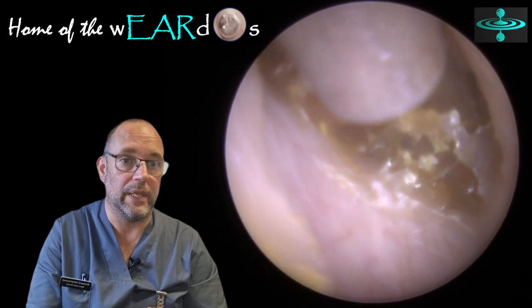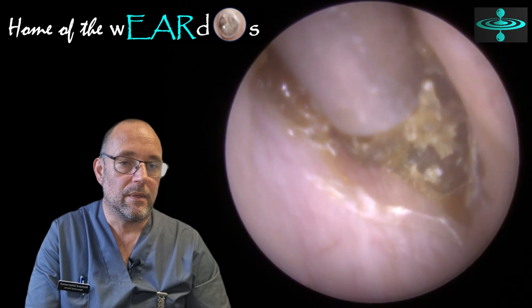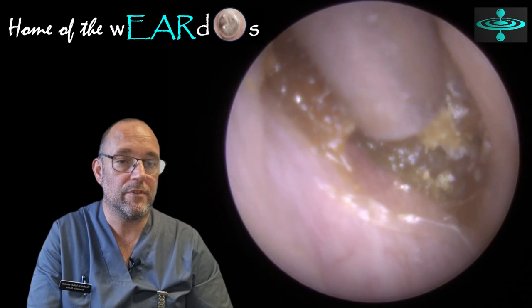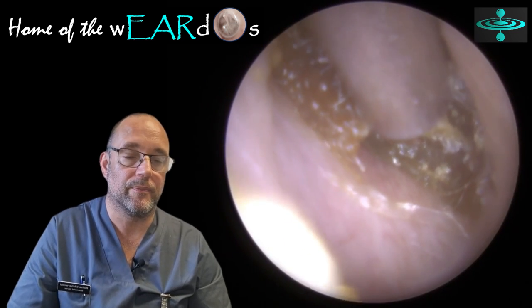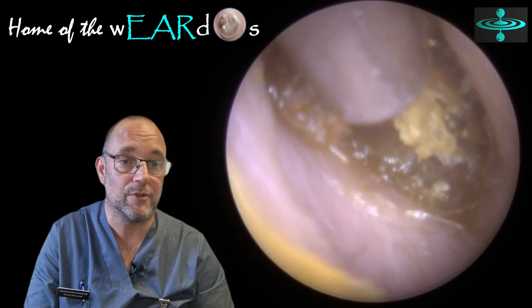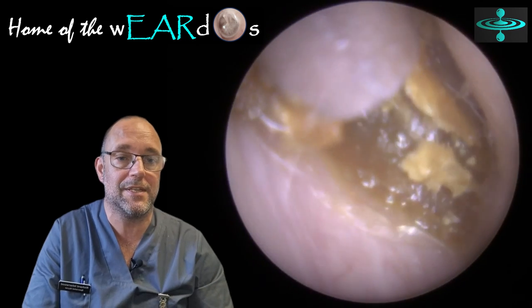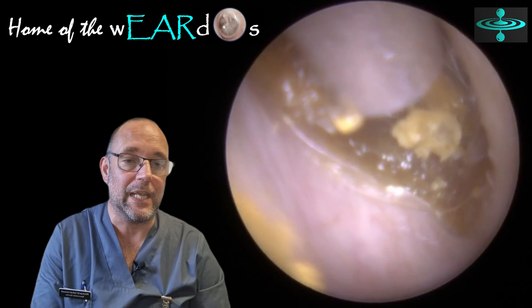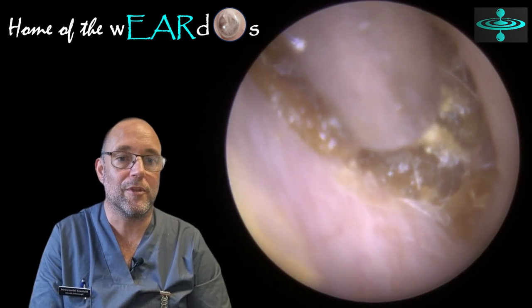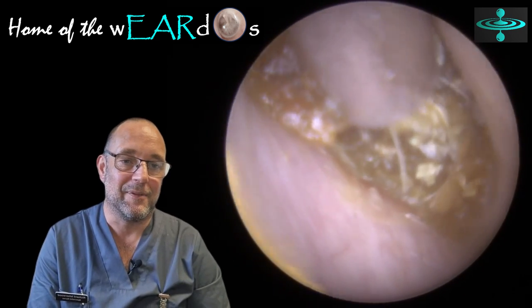I'm not surprised it's stuck either, when you look at the size of this ear — how small it is. I've got no problem getting a grip here, but then when you actually try and pull, you can see it's just really wedged in there. It's probably why this chap had problems, to be honest. He was of a good age, and it was his wife that was forever poking buds in his ears. I've obviously told him to stop that. He came with his daughter as well — hello if you're watching and you've managed to find the channel. Hopefully she'll remind them: throw the cotton buds away, stick them in the bin. Check the label — it says don't put them in your ears.